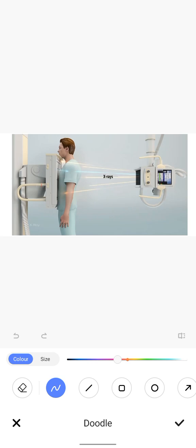Here you can see clearly the X-rays coming out of the X-ray tube through the window and striking the posterior side of the body, then getting into the body and coming out of the anterior side of the body. This is the anterior side of the body, and at last the X-rays are passing to the detector or the bucky, and these X-rays are getting all the information from the body and reaching the detector.